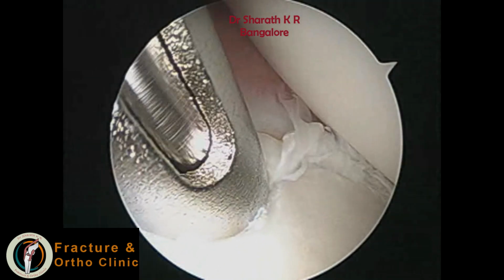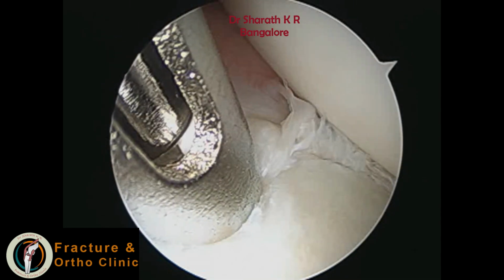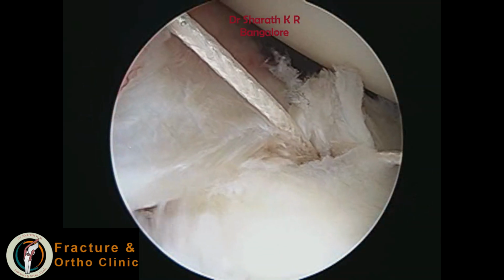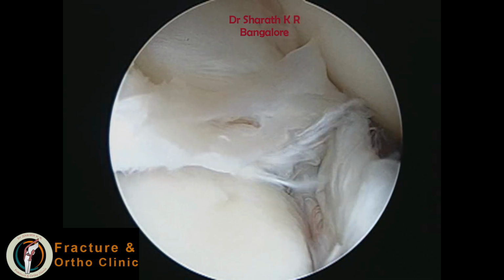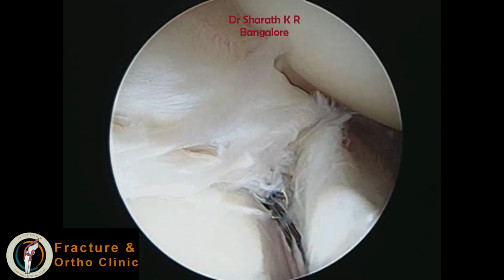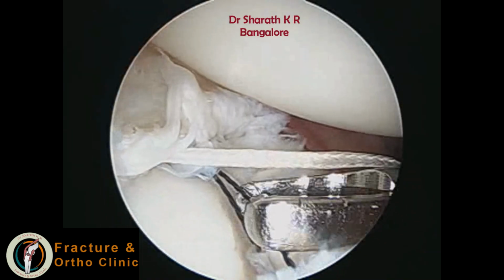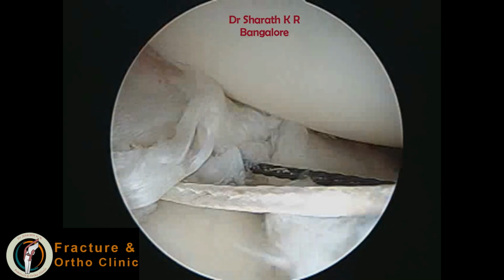One of the limbs of the suture is taken from the posterior cannula, and then shuttled using the lasso loop snare. The shuttle thread is now coming from the anterior portal.